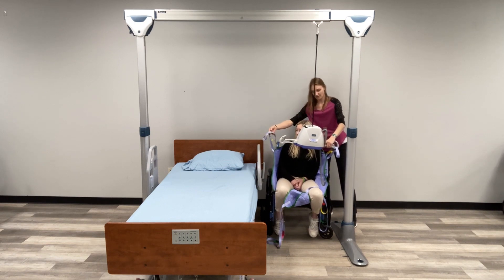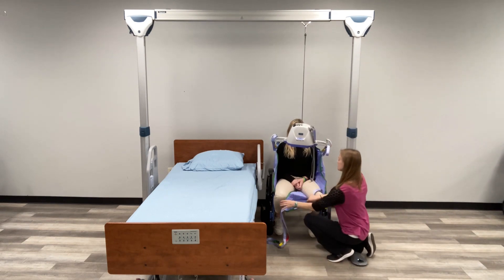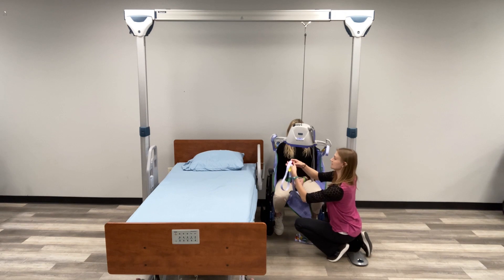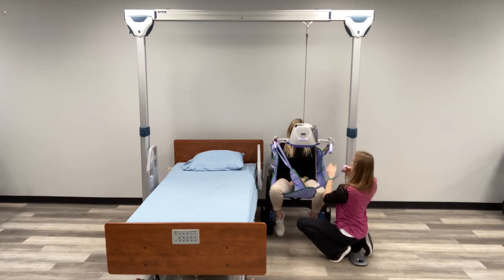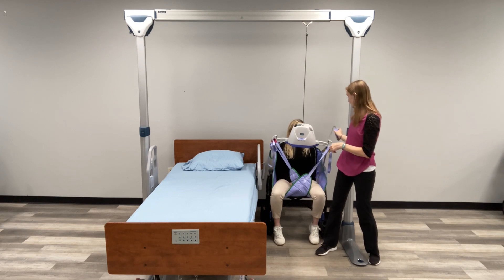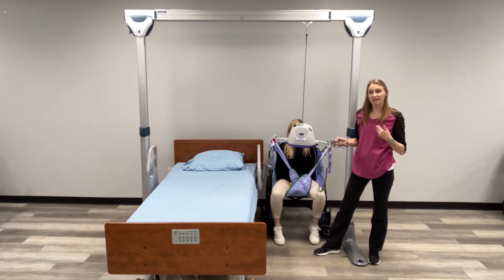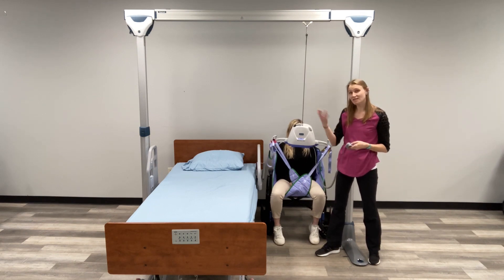I want to make sure that colors are matching across the shoulders. Then I'm going to take the straps that are underneath the legs and crisscross those straps whenever I'm in this type of lift. One benefit of this type of lift is that the remote control unit can be operated by either the caregiver or the client. So if your client has the capability to operate the remote, they can go ahead and lift themselves. Otherwise, it's as easy as the press of a button.